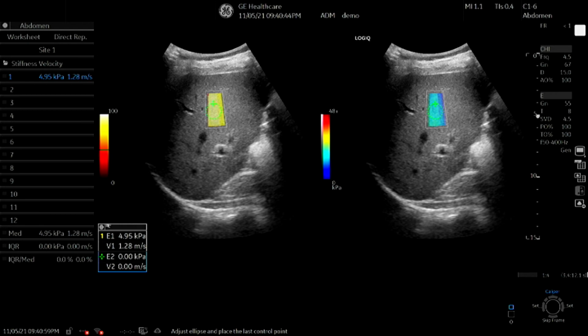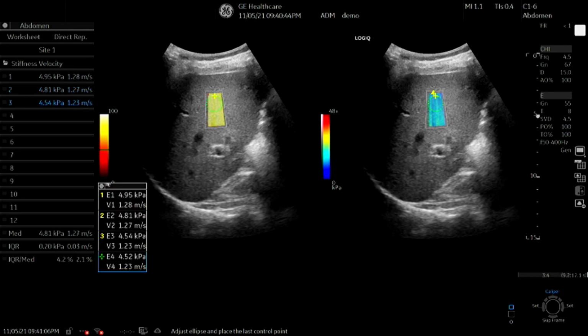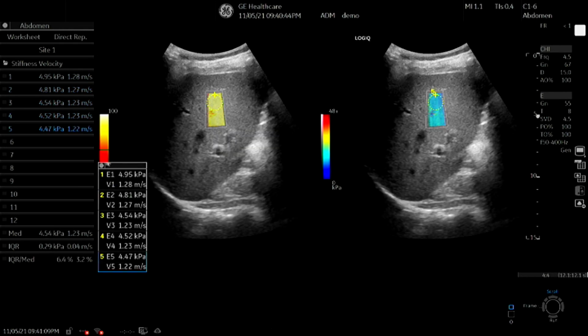It will take me automatically to the next step, and I can do the measurement again. Same story on the other and I move forward. As long as I got 5 consistent values, that's good enough. No need to go for the 10 measurements, and that is validated right away.